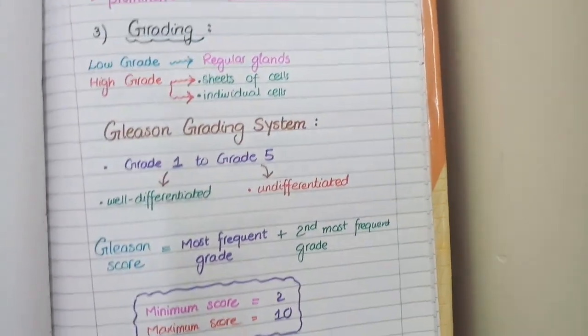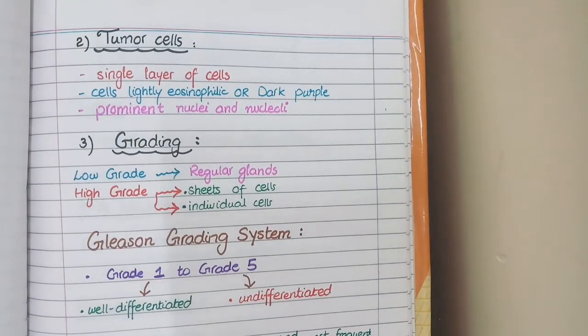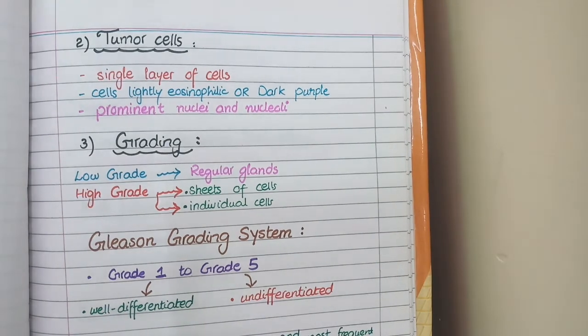Secondly, you see the tumor cells are arranged in a single lining instead of two-layered epithelium. And the cells are lightly eosinophilic or dark purple with prominent nuclei and nucleoli.